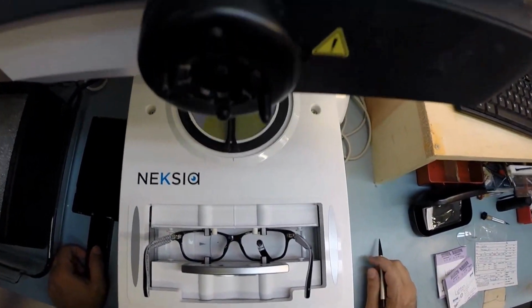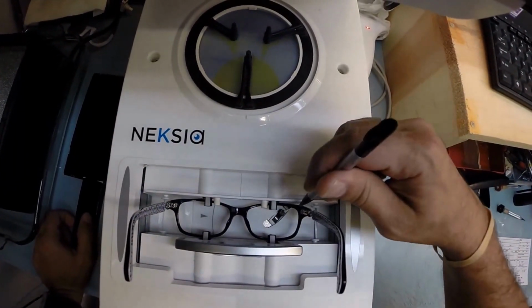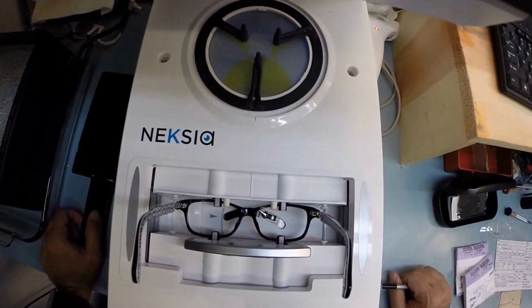And everyone wants to know, how does the computer know what shape lens to cut? This is why. That little stylus is going to go around and trace the shape of the right lens, and then do the same thing for the left.